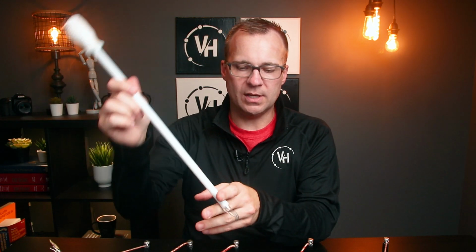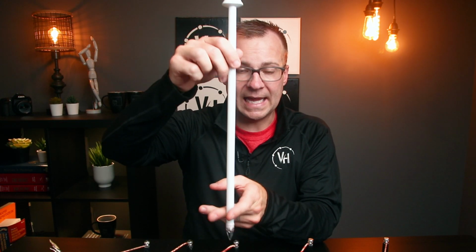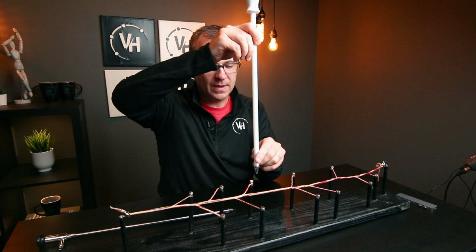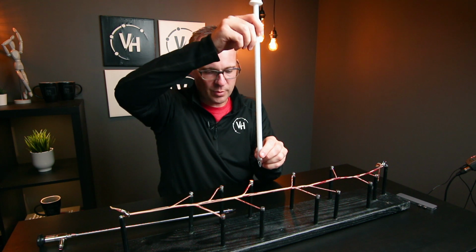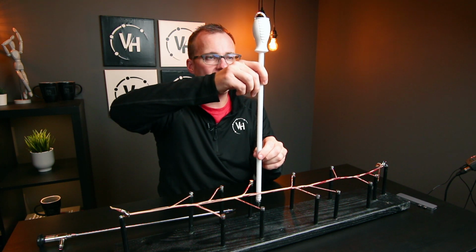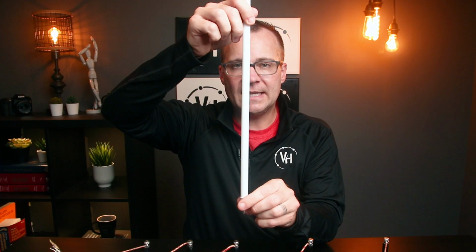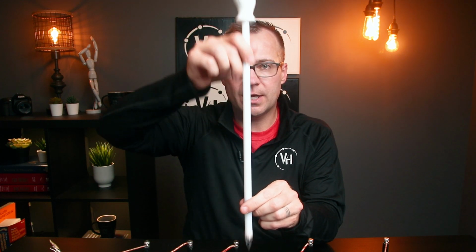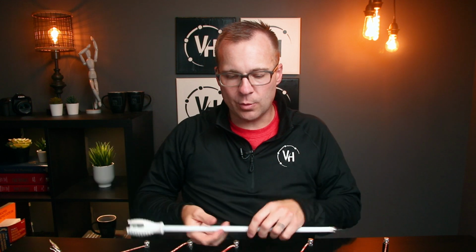So the key to finding it in that situation is to insert the scope vertical again. And the reason for that is that there's only so many places this vein can be. So if I put my scope in and I go straight down and it's not there, I can pull my scope up and I can lean it towards me or away from me, and I can continue to look in that plane. It's almost like we're picturing the leg as a CT scan slice of the leg, and we want to stay in that plane.